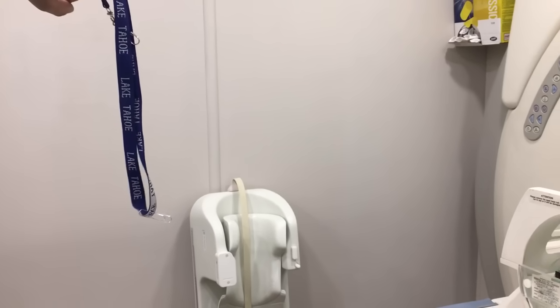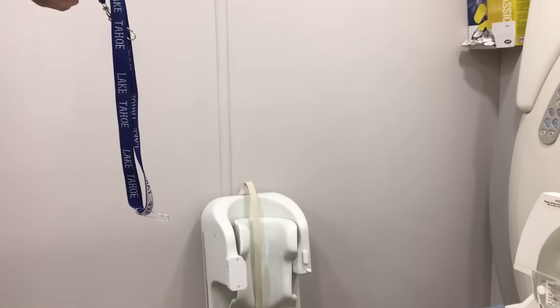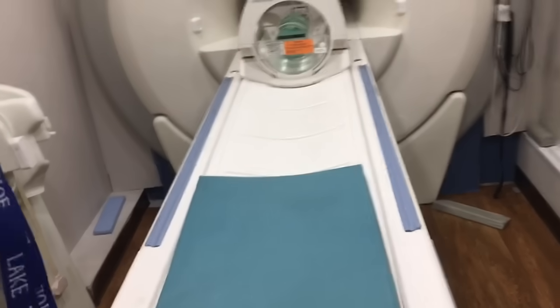It's about halfway from the table, maybe about five feet, where the eddy currents start to take place, but there's actually no magnetic pull yet. It looks like cell phones are pretty safe — it works so far.